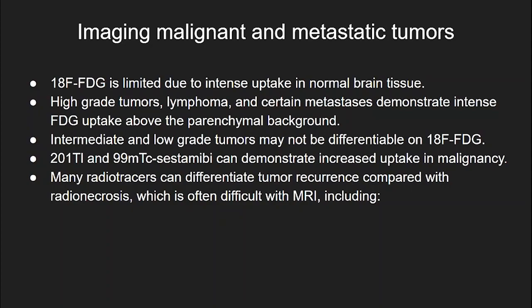And many radiotracers can differentiate tumor recurrence compared with radionecrosis, which is often difficult with MRI alone. Some of these radiotracers that have been used in the literature include 18F-FDG, 201 thallium, 99m technetium sestamibi.